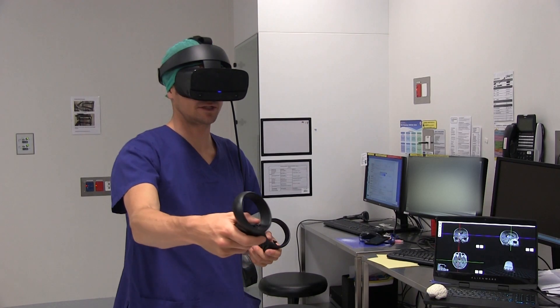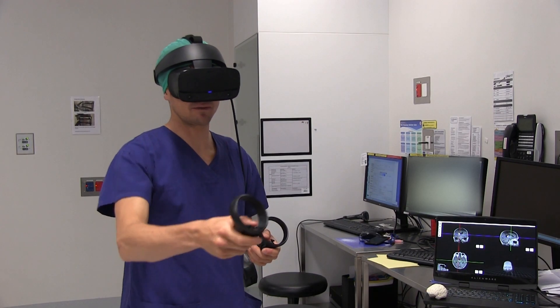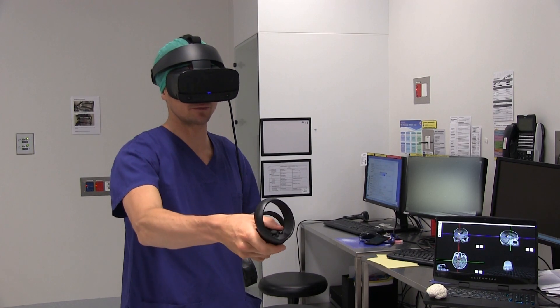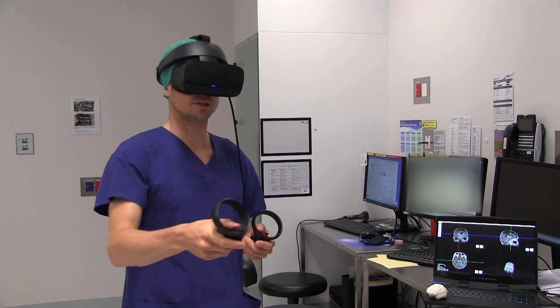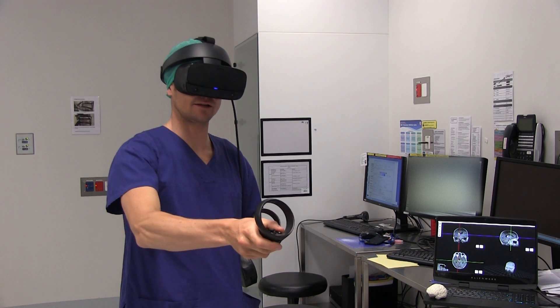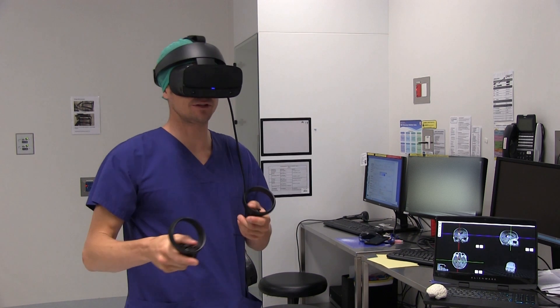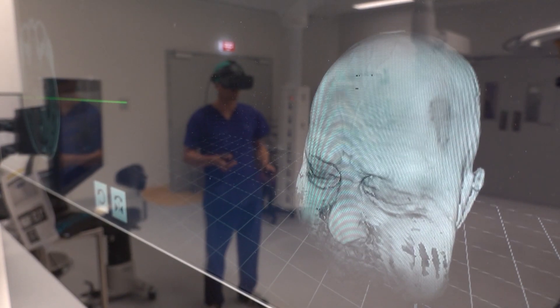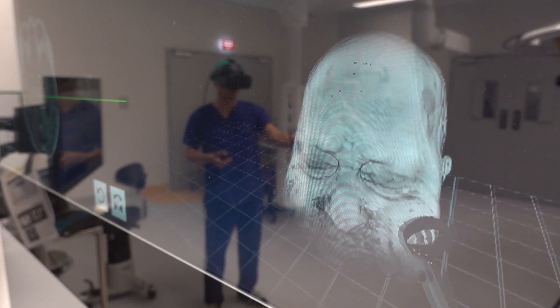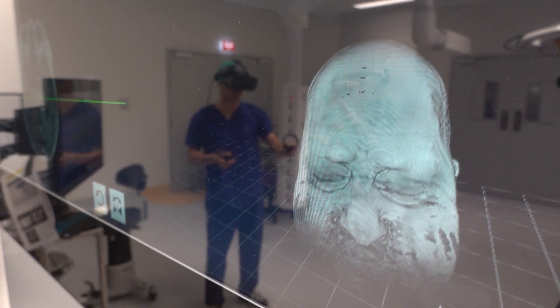This 60-year-old male patient presented with seizures, and the CT scan and MRI revealed two lesions. I can use MedVR to go through the MRI.